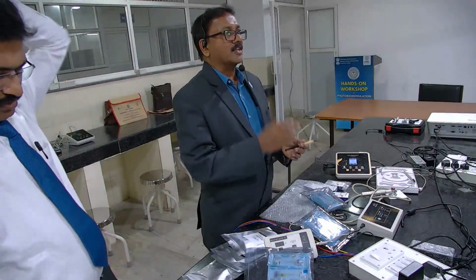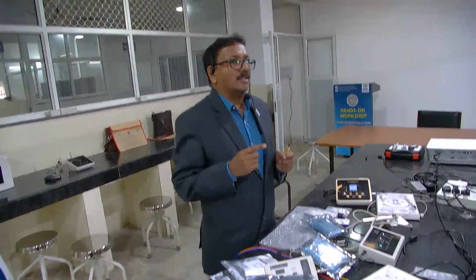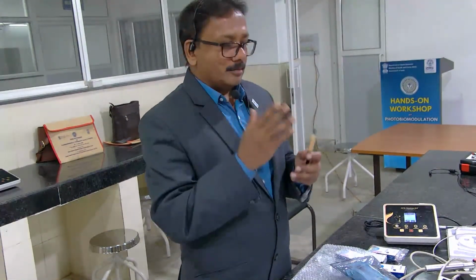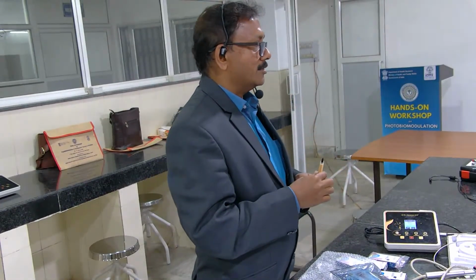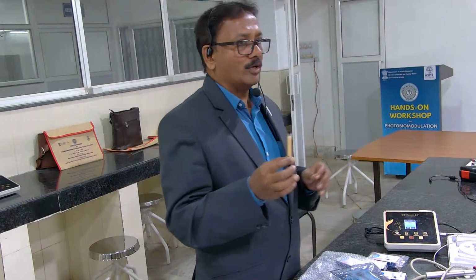So all you have to do is first do the scaling, because once you have plaque accumulated on the teeth, there is no drug in this world that can breach the plaque. Not even chlorhexidine, which is the gold standard. So how can this reach when you have plaque there? So do thorough scaling, thorough cleaning if you want, but don't use it on the roots. After thorough scaling, polishing is very, very important, because you are priming the enamel to receive this agent. Then only you can have beautiful results. Be it hydrogen peroxide or anything, see that you do scaling and polishing as the first step, and then only go for any whitening agents.